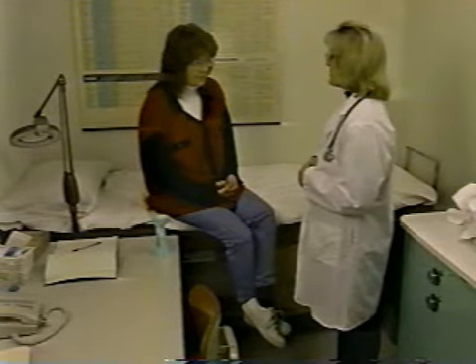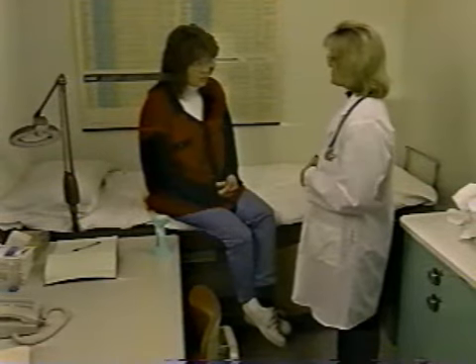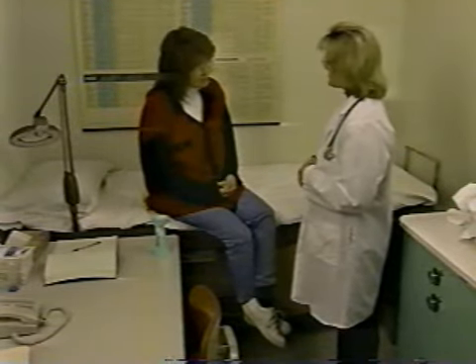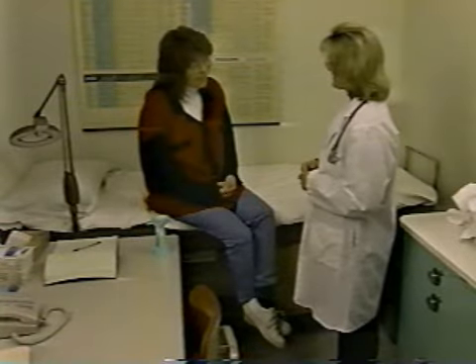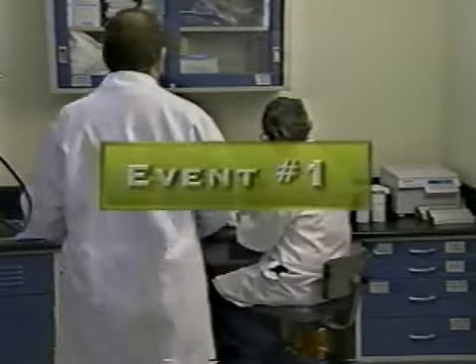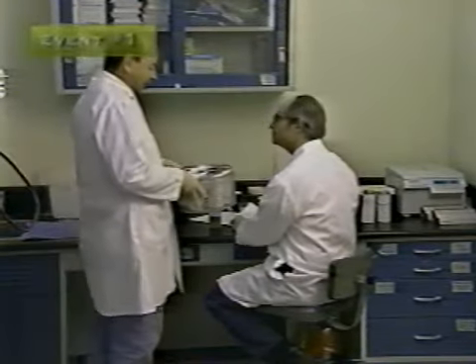Because specimen collection is not done in the laboratory, we will not be discussing it in this program. It is important, however, to be aware that contaminants can be introduced when the specimen is collected. Let's start with the first phase of the laboratory testing process.